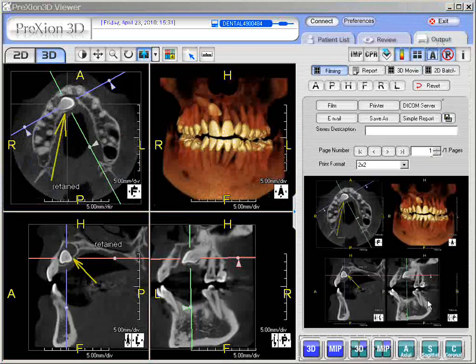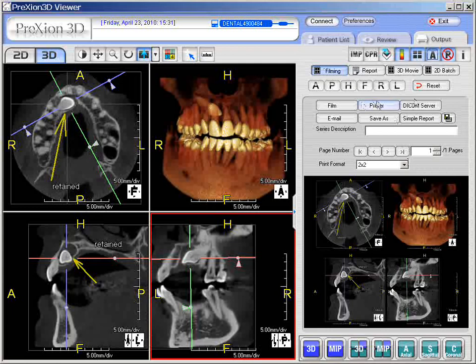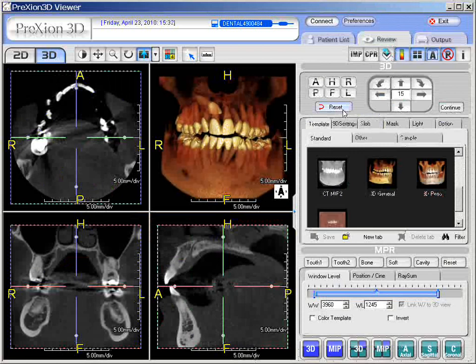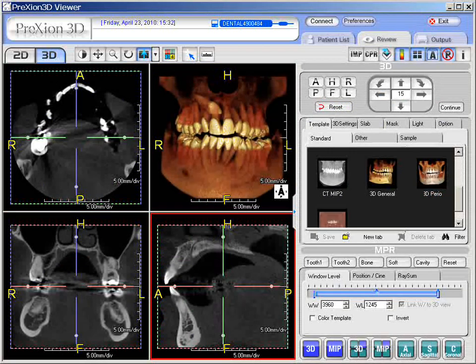In the output panel you have your images that you've captured and saved. You can do things like print them, save, send to DICOM, email, etc. Once you're finished with the output panel, you can go back to the review tab and reset. Reset even takes your arrows and texts out as well, so it's a nice feature to use. That should conclude our section on annotation and adding labels and arrows.